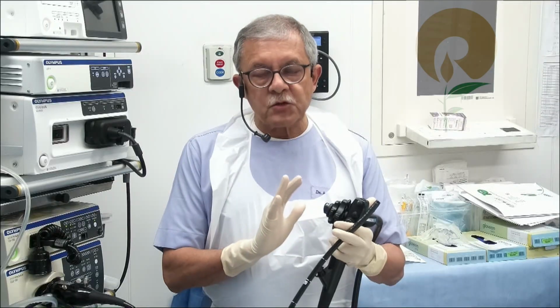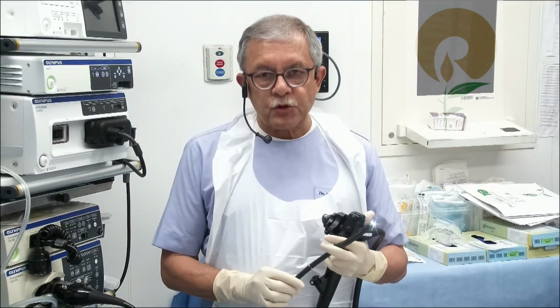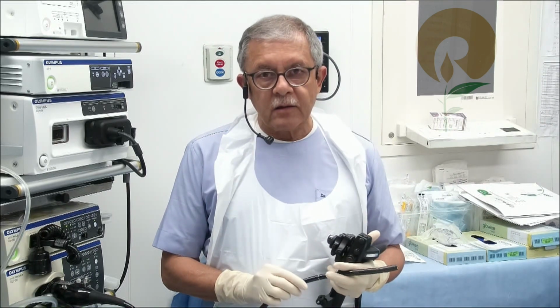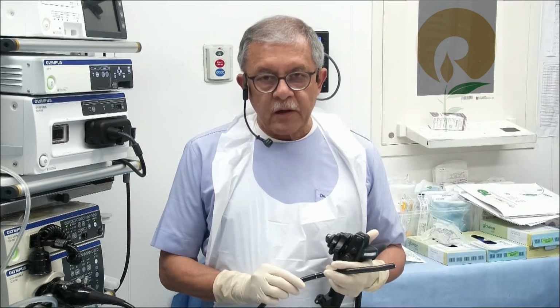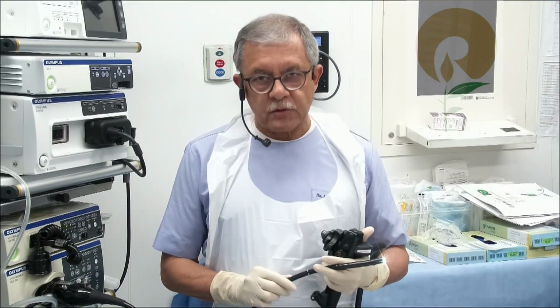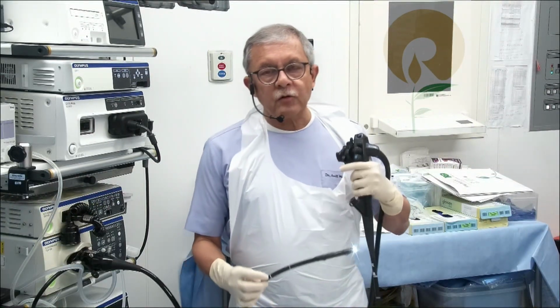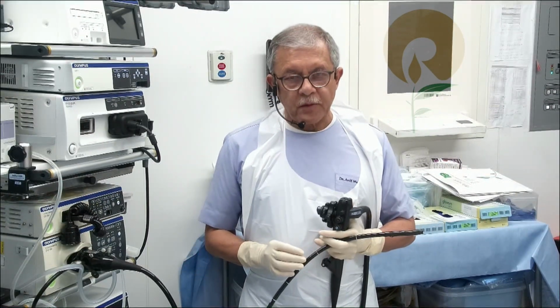So now these were the parts of an endoscope. In the next section, I am going to show you how to handle and how to hold the endoscope, in which position to position the patient to perform an upper GI endoscopic procedure. So I am going to describe to you now the actual procedure of upper GI endoscopy.